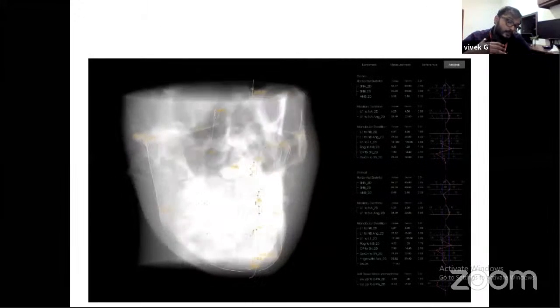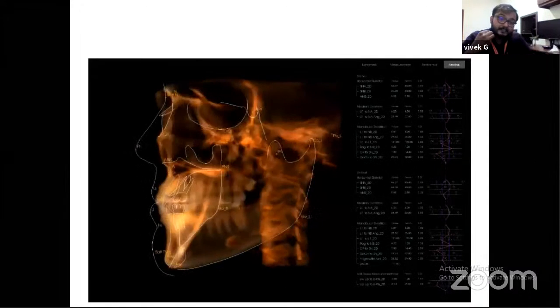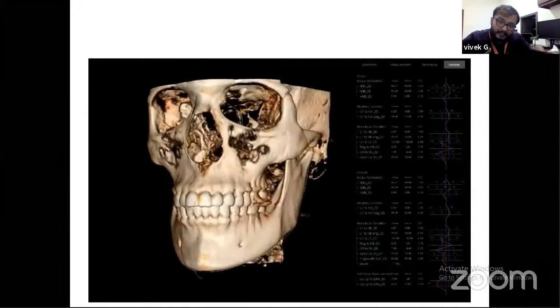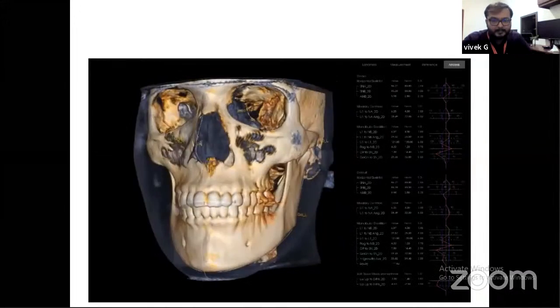If you are academically oriented and going for a certain analysis, 3D cephalometry can help you with this. We need to just mark out certain landmarks in the patient scan, and the software will do the analysis on its own and give you the measurements and the parameters.